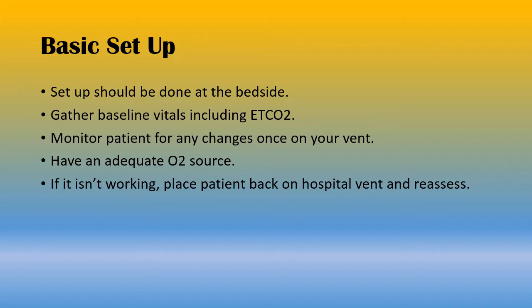You also want to make sure you have an adequate oxygen source. On 100% FiO2, every bit of that breath is eating up your oxygen. So keep that in mind as you're thinking about these transports. Even before you leave the station, make sure you have a good main that's full of oxygen so you can take that transport without running out of it.